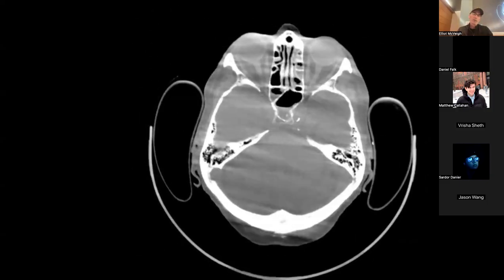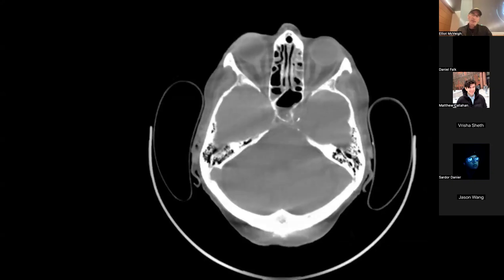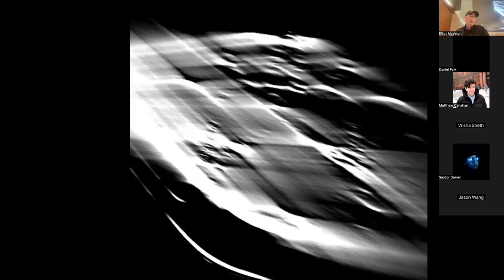And this is what happens when you do that with all of the raw data. You eventually project this back and get a decent picture, right? And if we go back and look at what's happening here, this is just one view, maybe 2 or 3, 4 or 5, 6 views, okay? So now we have a lot of projection views that are going through the sample sort of on the angular left-right axis or this axis up this way.